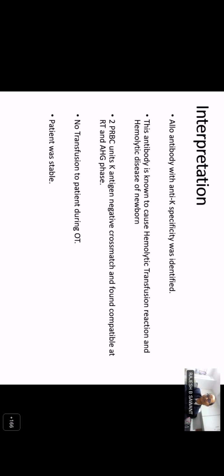Dr. Jayasri asks, for donor screening, is a 3-cell panel used in all donors? No, it is not a mandate currently. So you may use pooled O cells also for donor screening, which many blood centers still use. And of course, if resources are available, you can use a 3-cell panel for your donor screening.